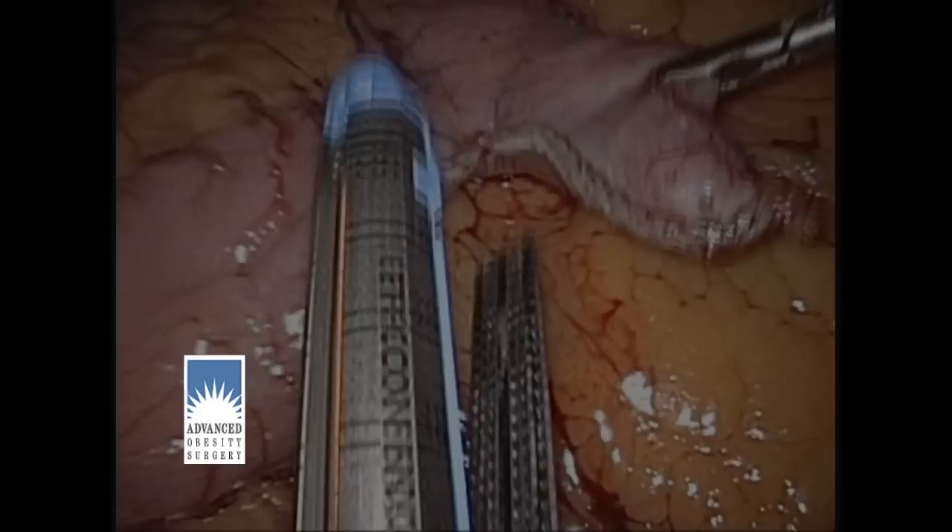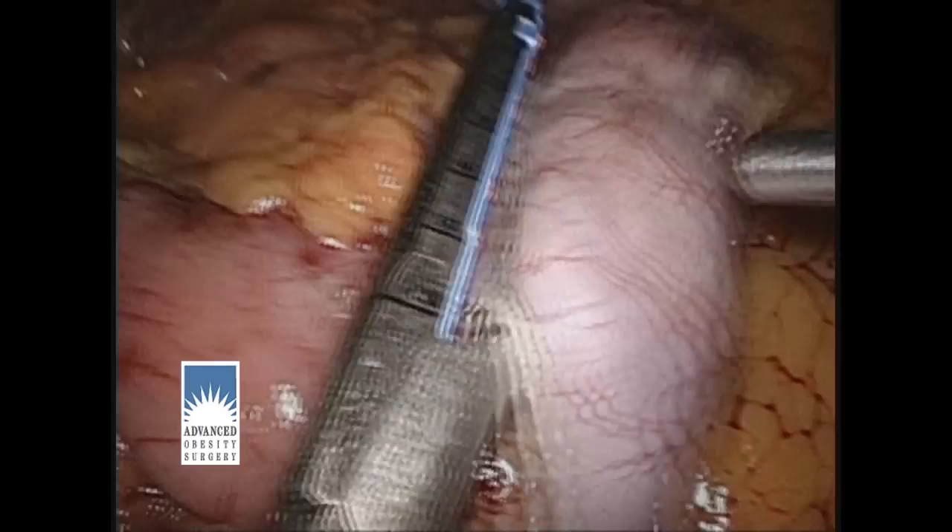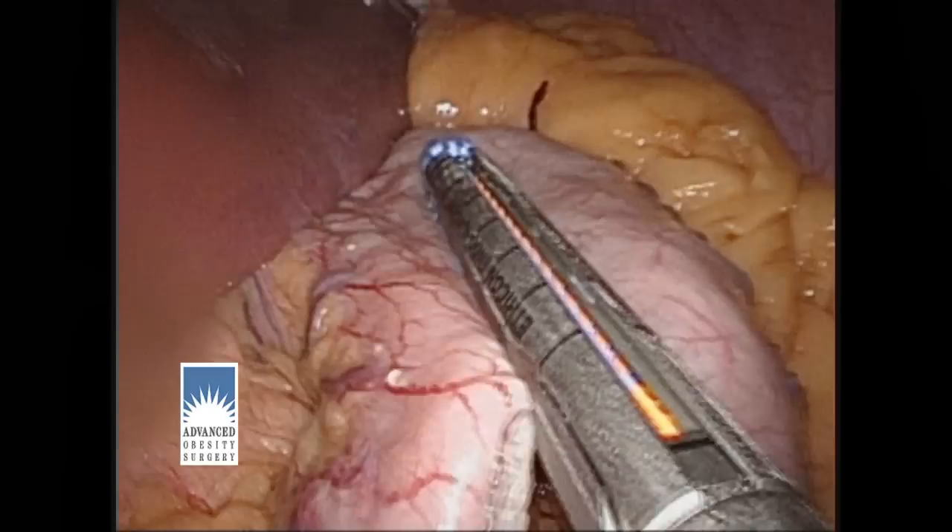I'll now use another stapler cartridge and travel up along the stomach, creating a narrow tube for the remaining stomach. As we create this narrow tubular stomach, you can appreciate how this smaller stomach will cause someone to be satisfied with a much smaller amount of food. In fact, these patients eat about the same amount as our Roux-en-Y gastric bypass patients over the first couple of months after surgery.